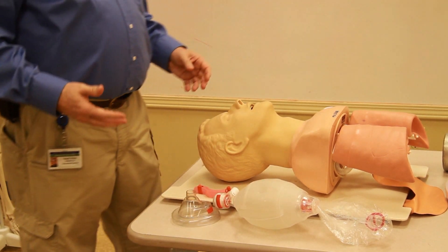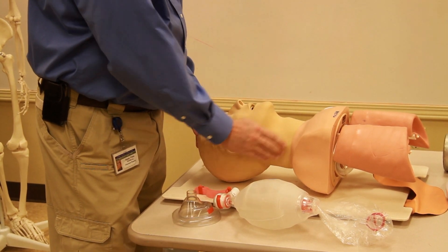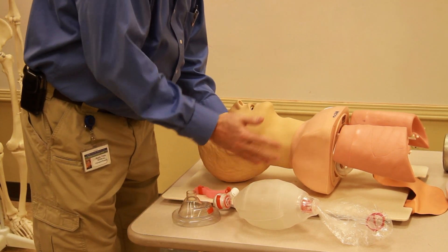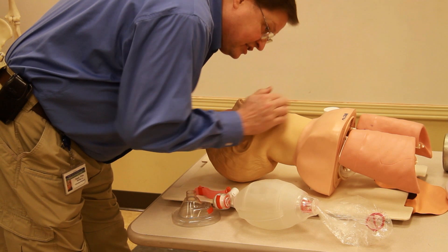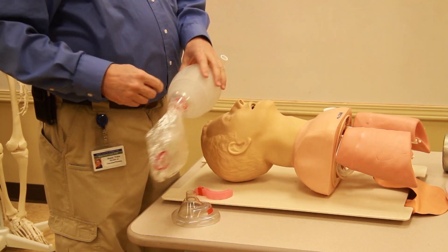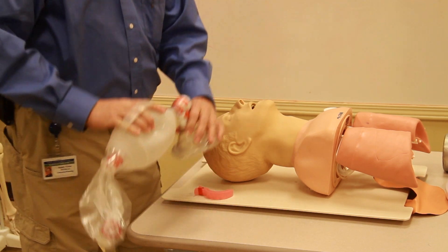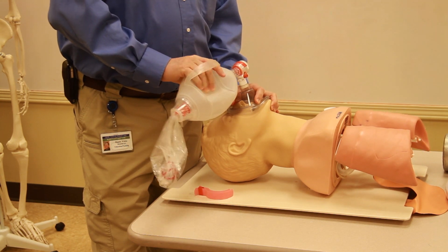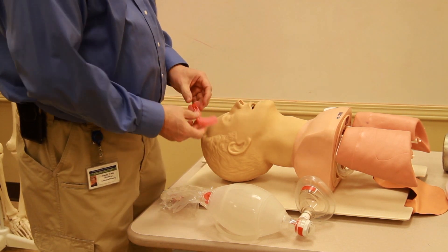As with any other airway, we go through our routine: sir, are you okay? We check for a pulse — the patient has a pulse. With no neck injury, we perform a head tilt chin lift, look and listen to confirm the patient is not breathing. If not breathing, we ventilate — no oxygen attached due to time constraints — two ventilations.